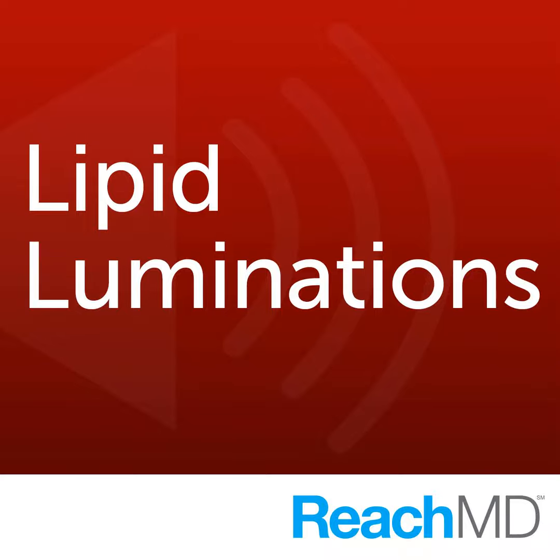So to summarize the appropriateness criteria, the bottom line was very similar to what everyone thought before: carotid IMT is useful for patients of intermediate risk, and that really was the main indication where it was felt to be appropriate. The patient that is high risk and the patient that is low risk were not felt to be appropriate for use of CIMT. And the reason is you don't really need it, right? If they're low risk, you're not going to be too aggressive with treatment. If they're high risk, you've got to treat them aggressively regardless, right? Yeah, exactly. In the intermediate group, Alan, it helps you decide how nervous to be about that group.